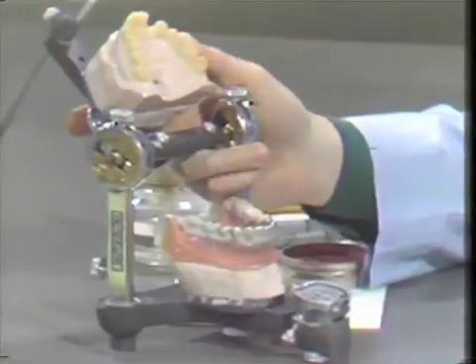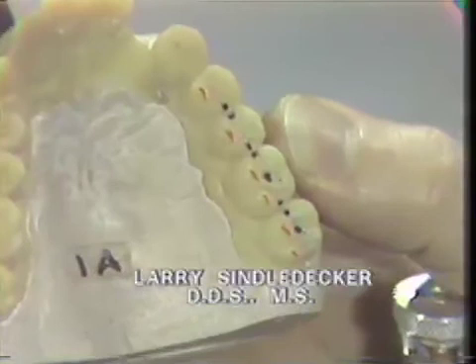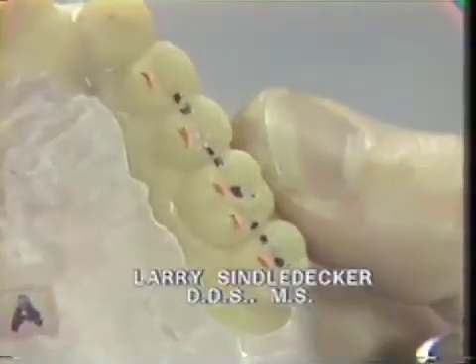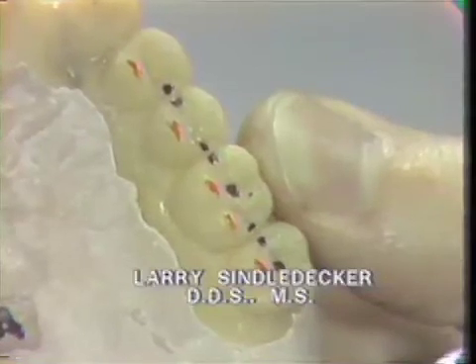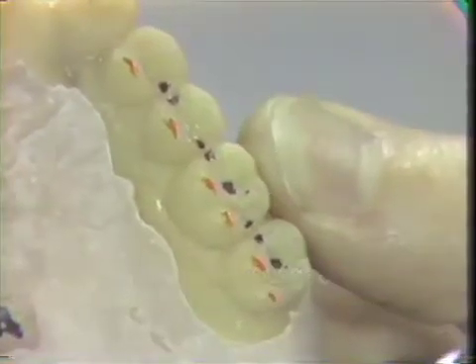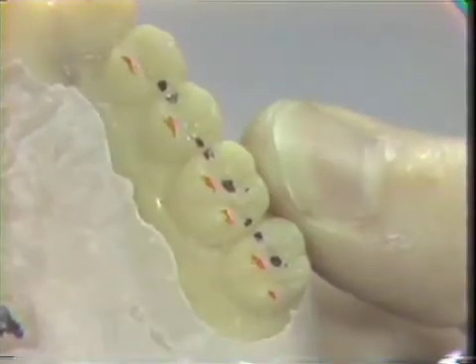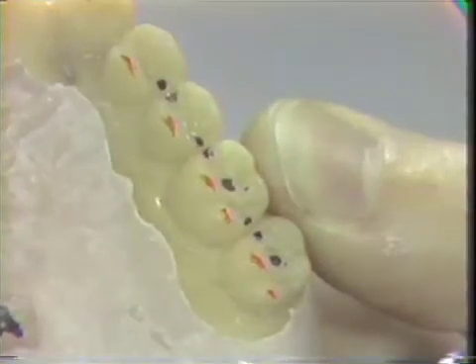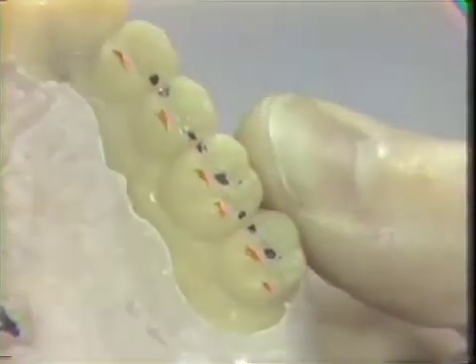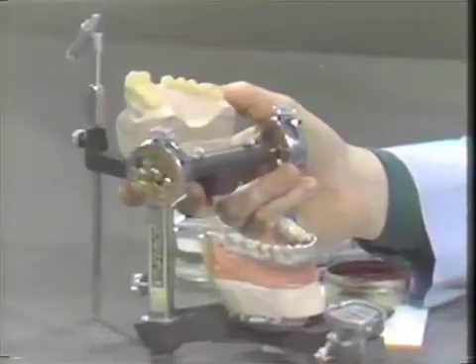And I'd like to direct our attention first to the maxillary cast, where we have marked the potential centric stop areas. The orange dots represent the centric supporting cusps of the bicuspids and the molars. And the black dots represent the centric stop areas which will be developed against the mandibular supporting cusps in the first step of our waxing procedure. This procedure will have 6 steps, so let's first off take the first step.